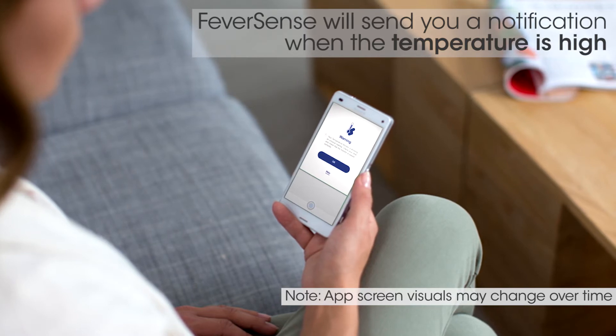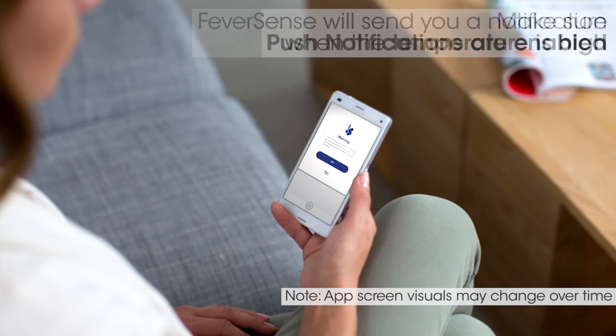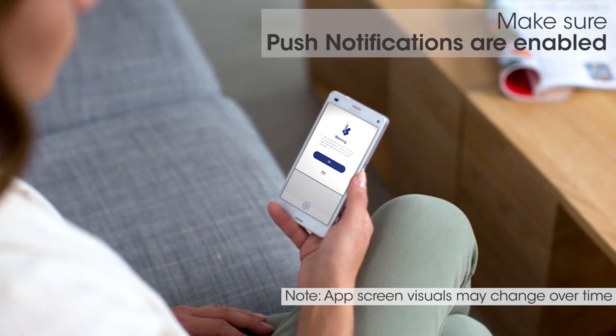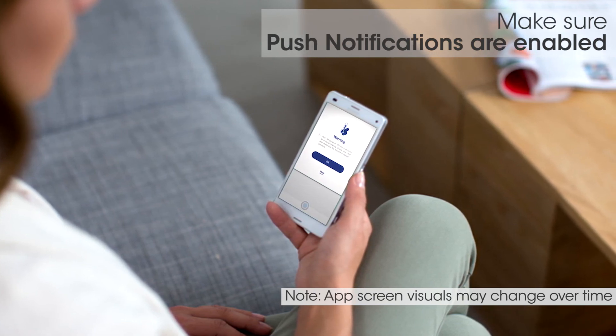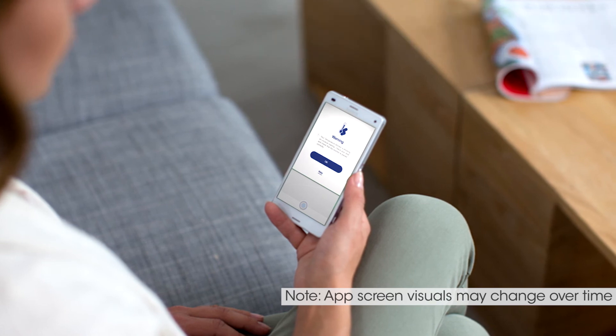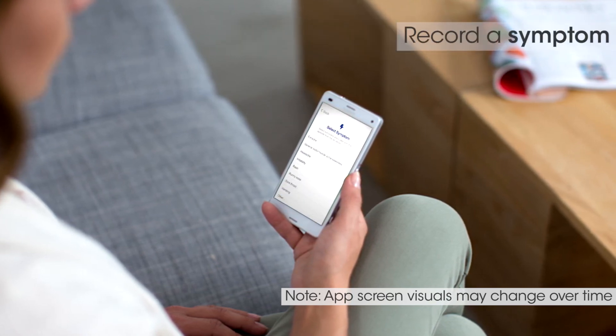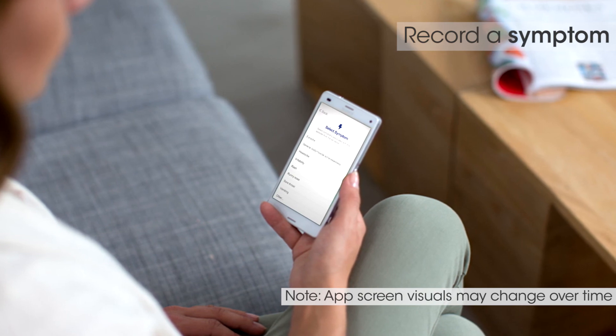FeverSense will send you a notification when the temperature is high. Make sure push notifications are enabled on your phone and your phone is not on Do Not Disturb, so you can get high-temperature notifications. You can track your child's medication history and record a symptom by clicking on the buttons on the home screen.